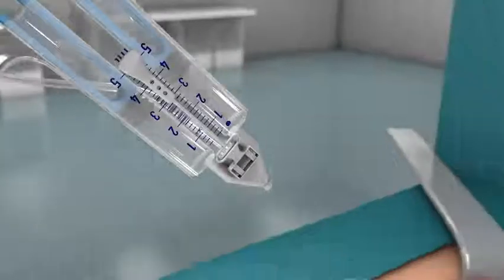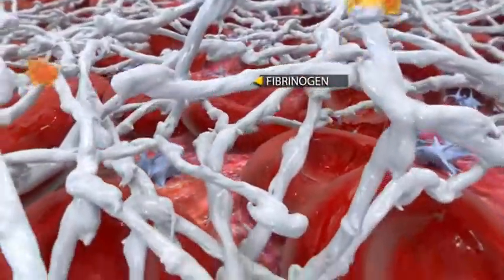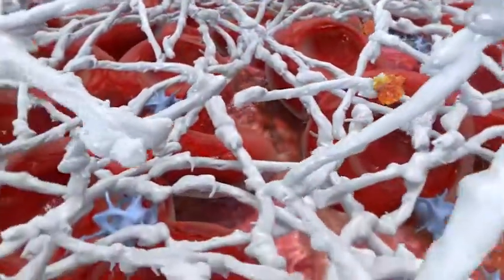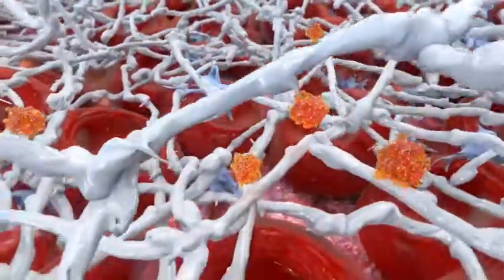When combined, the two components, fibrinogen and thrombin, mimic the final stage of the blood coagulation cascade, whereby soluble fibrinogen is transformed into a fibrin matrix that adheres to the wound surface and to the skin flap or graft to be affixed.